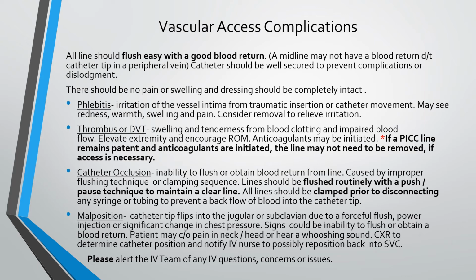Patients may complain of pain in the neck or head and hear a whooshing sound. Chest X-ray to determine catheter position and notify the IV nurse to possibly reposition back into the SVC. Please alert the IV team of any IV questions, concerns, or issues.